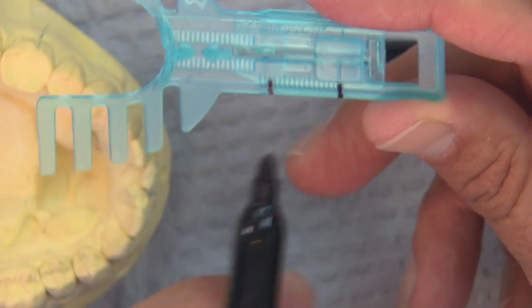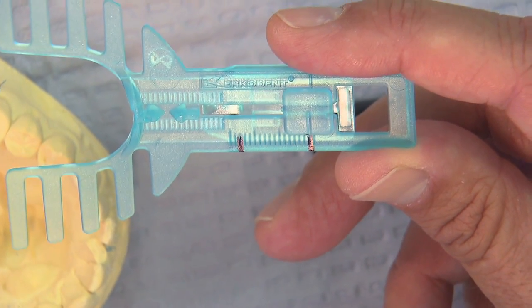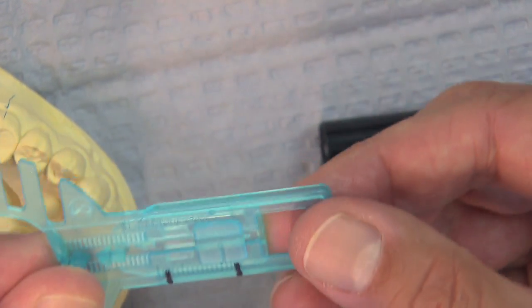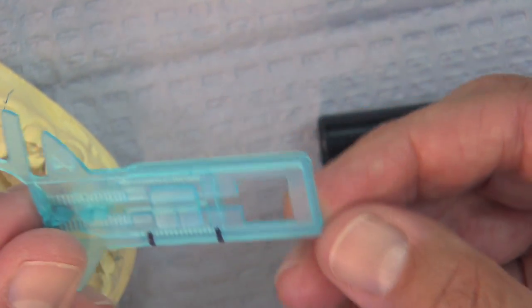So we have two marks here. This is the patient's normal bite, just biting together, and this is maximum protrusion. And really what we want to do is we want to go for 50%. We want to go right in the middle. We don't want to over anteriorize the mandible. We don't want to go any farther forward than we have to, but we'd like it to be effective, and the 50% mark is a great place to start.